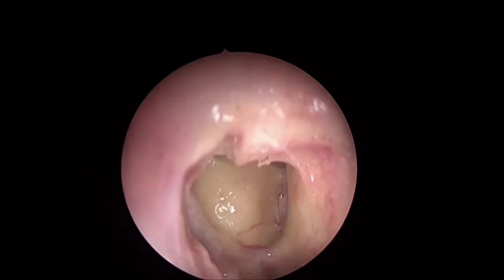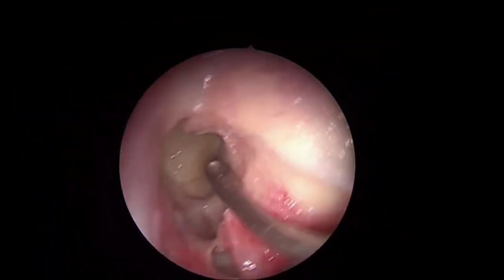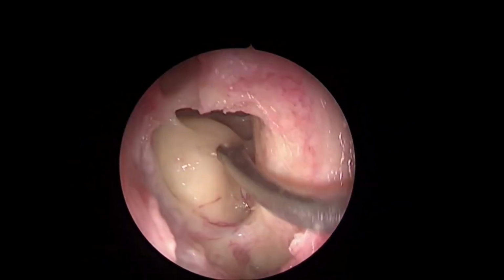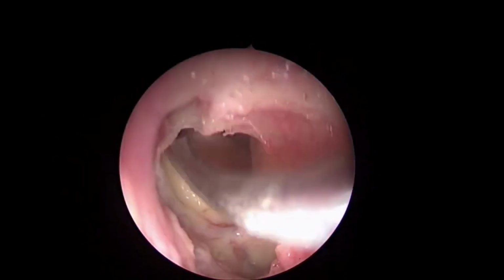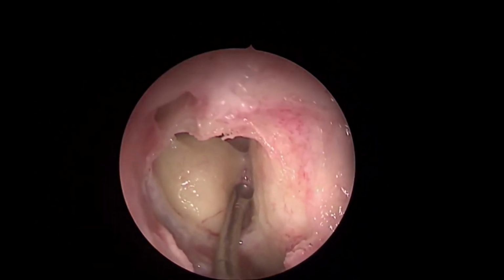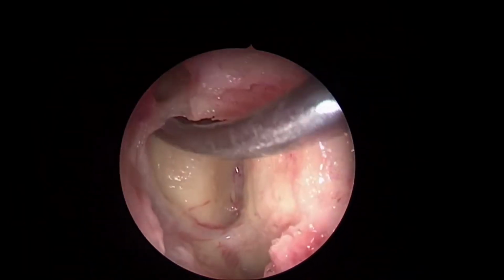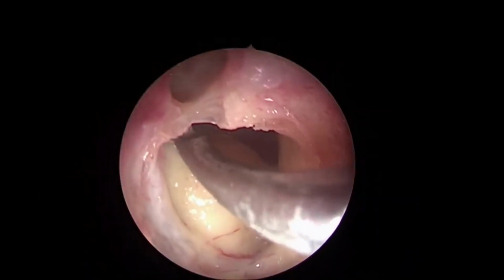Okay? Now, the cells behind, to enumerate, these are the cells anterior which I mentioned, the agger nasi and the Kuhn cells. Behind are the bulla cell, suprabullar cell, and frontobullar cell going into the frontal sinus, and so on. The supraorbital cell is a lateral cell pressing from the lateral side and narrowing the drainage from the lateral side. Similarly, a cell here most anteriorly is the intersinus septal cell, which narrows the drainage from medially.